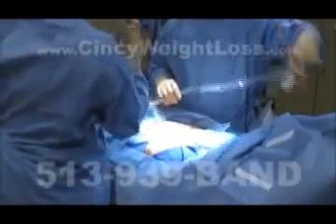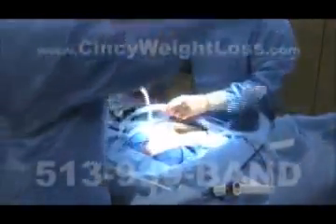Laparoscopy involves the use of a long, thin, fiber optic camera called a laparoscope, and even thinner precision instruments that combine to enable surgeons to perform delicate procedures without the need to open the patient.